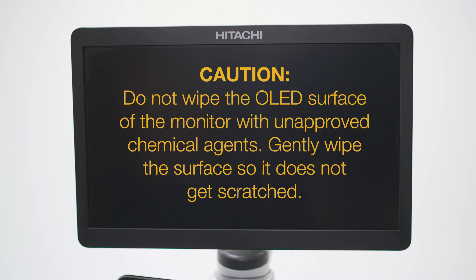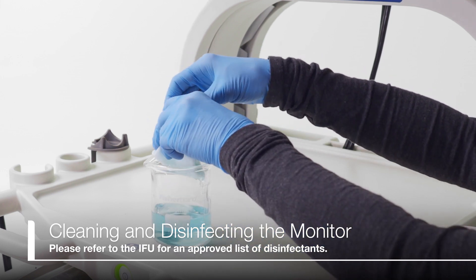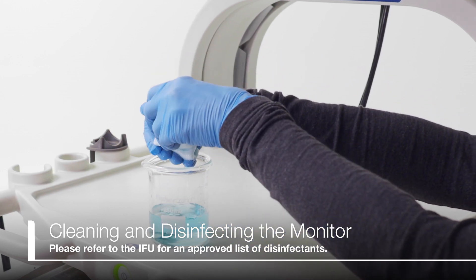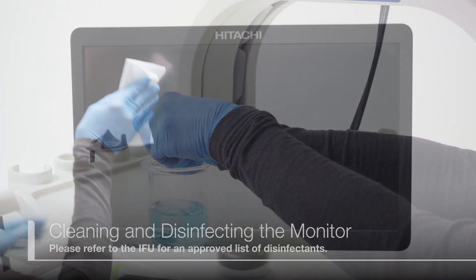Gently wipe the surface so it does not get scratched. Dampen a soft lint-free cloth with a neutral detergent diluted with water and thoroughly wring it out, or use an approved disinfectant if disinfecting, and wipe the monitor.